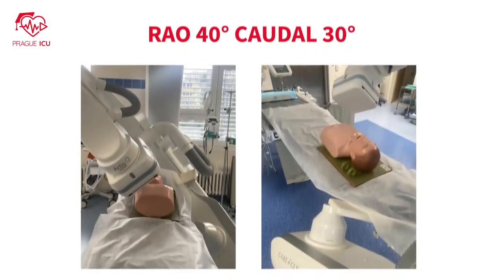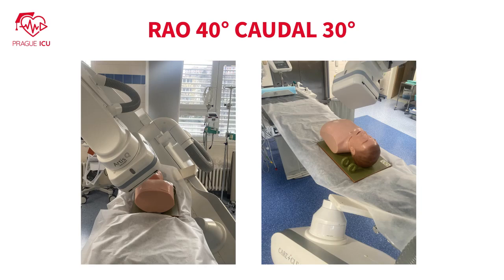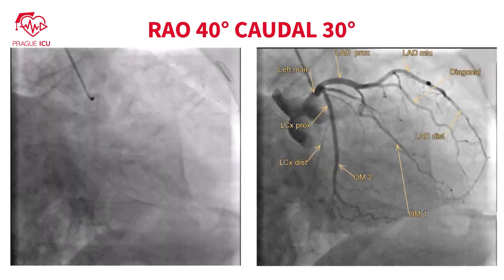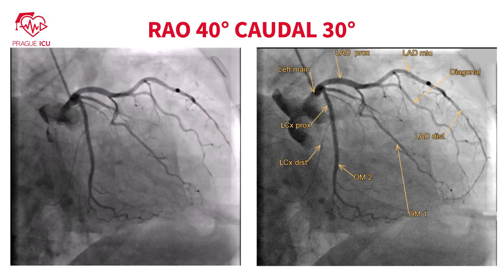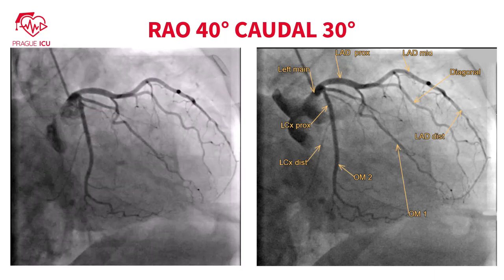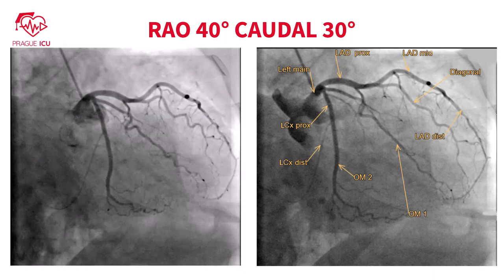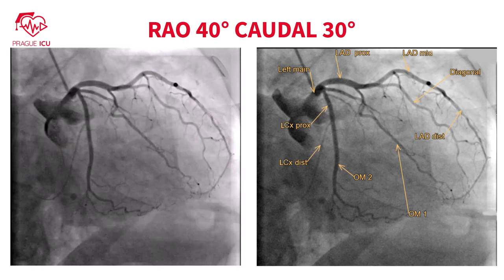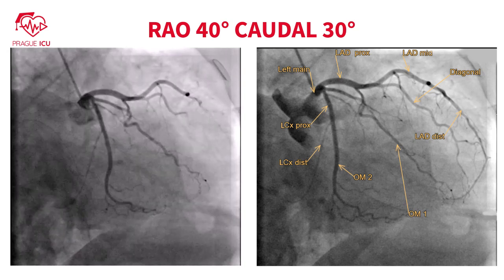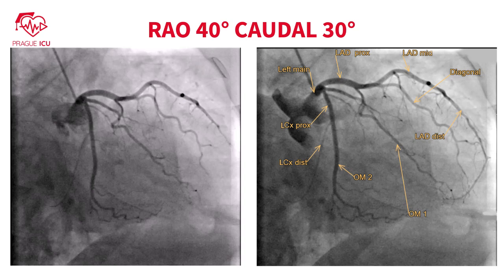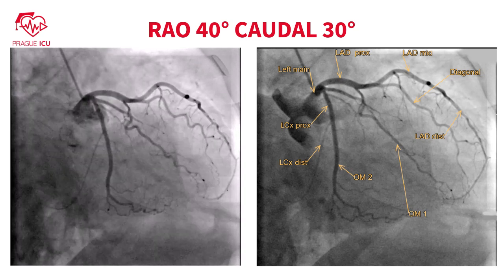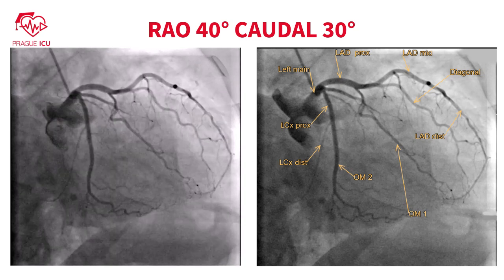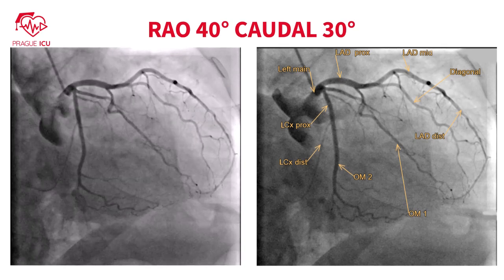Right anterior oblique 40 degrees caudal 30 degrees view is suitable for visualization of the proximal LAD and the proximal to mid circumflex with its branches. In this view, the first marginal branch can mimic the intermediate branch, but the spider view clearly demonstrates that this branch is arising from the left circumflex.